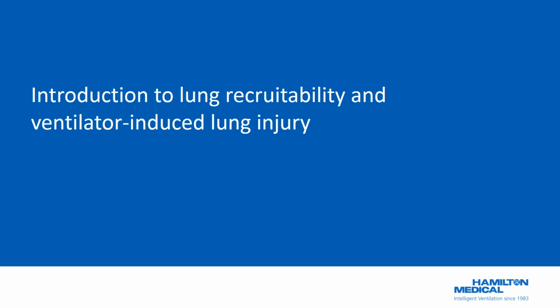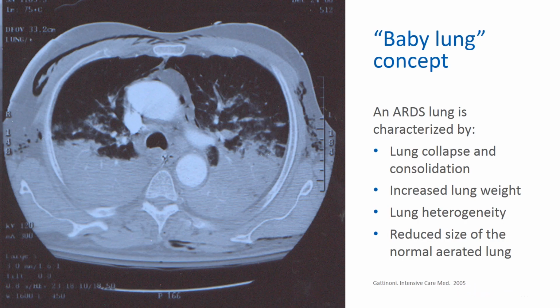Let's begin with an introduction to lung recruitability and ventilator-induced lung injury. An ARDS lung is characterized by lung collapse and consolidation, increased lung weight, lung heterogeneity, and a reduced size of the normal aerated lung. This is called the baby lung concept.